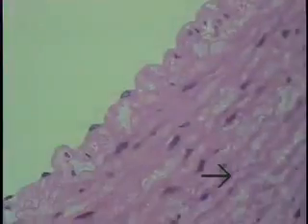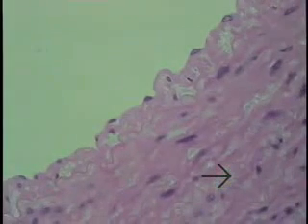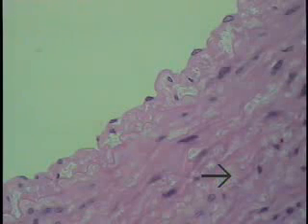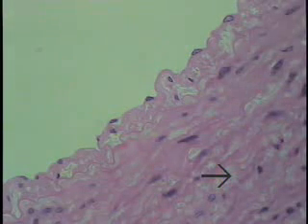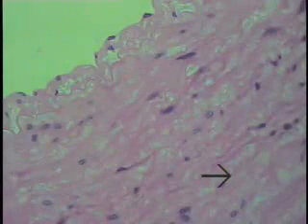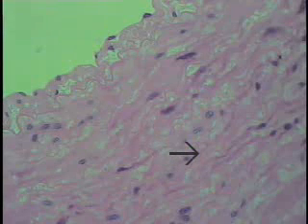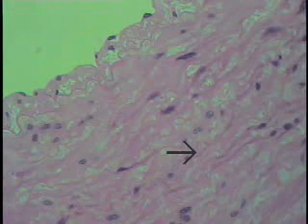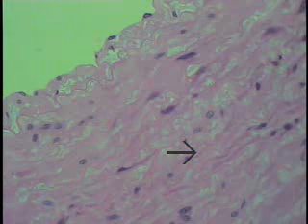In a normal H&E of a paraffin section, the media of the arterial, or this aortic wall, will look like it's comprised mainly of smooth muscle. But remember, one of the reasons for naming this vessel an elastic artery is because of the predominance and abundance of these elastic laminae, which form sheets and circumferentially go around the lumen as a protective type of mechanism. Now examine an aorta that has been stained specifically to demonstrate this particular material, that is the elastic laminae.